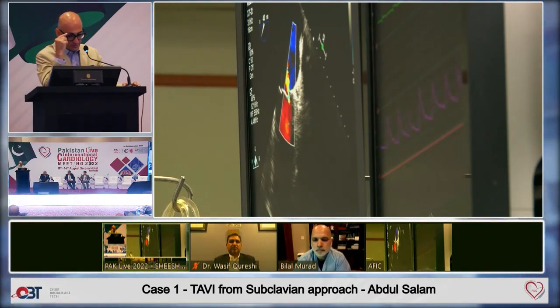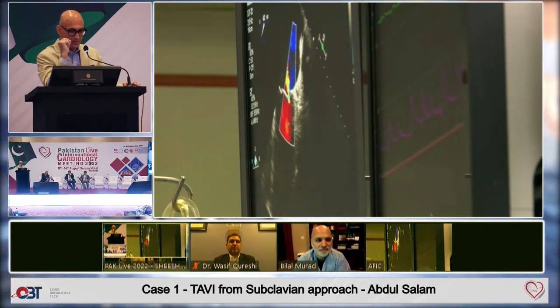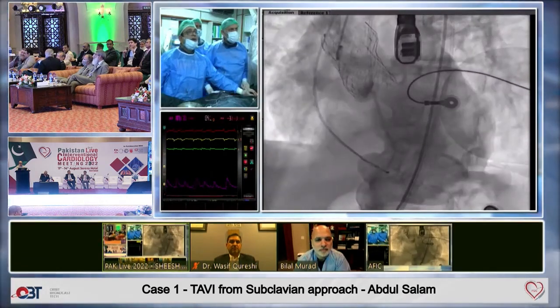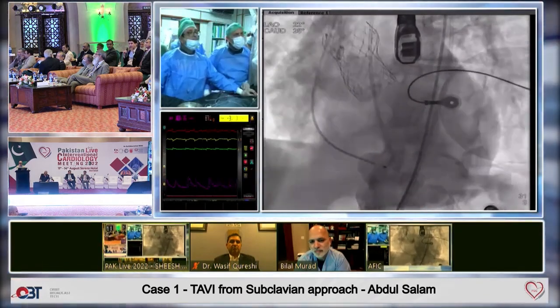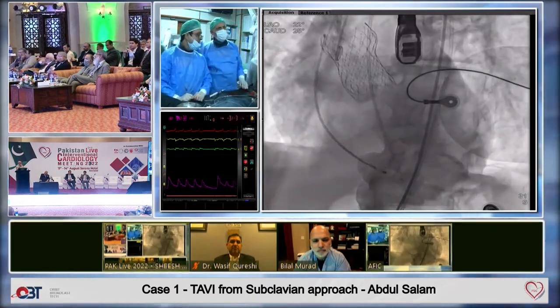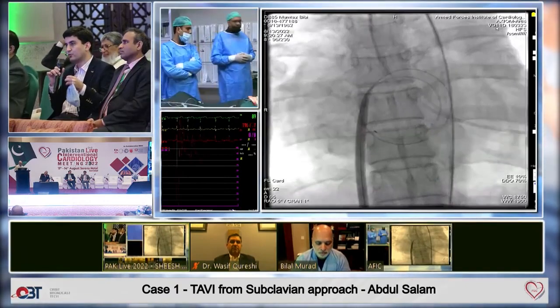So one short question, if you allow me, please. Yeah, thank you very much. It was an excellent presentation and nicely done case. I want to ask two things. One patient, for example, a short stature female. Her aortic annulus diameter was hardly 13 or 14 mm, and she's been refused by the AVR. What kind of suggestion would you put up for this TAVI? Secondly, how much AR is acceptable post TAVI, and unfortunately if the TAVI procedure leads to mild or moderate AR, what kind of rescues are you going to do in this case?